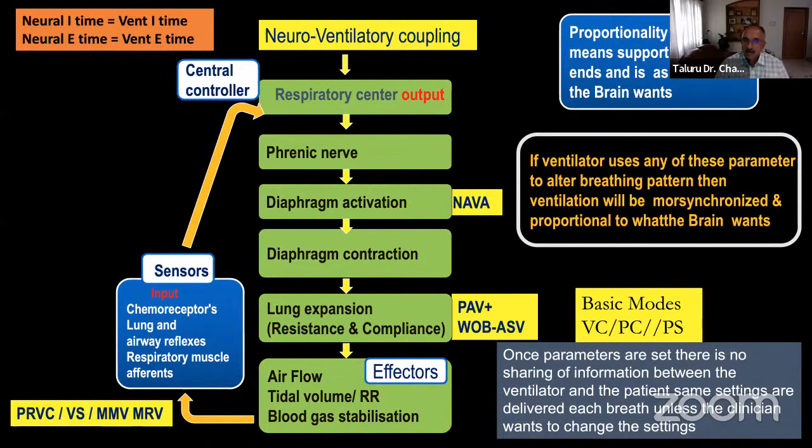neural in a COPD patient, there is an expiratory flow limitation, carbon dioxide is going up, patient is becoming tachypneic, probably requires more expiratory time. We don't have a means of looking at that time.